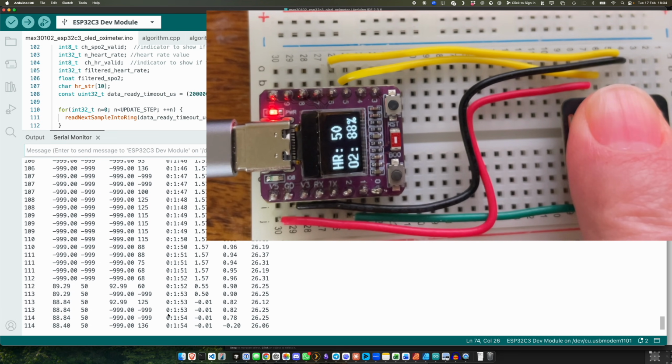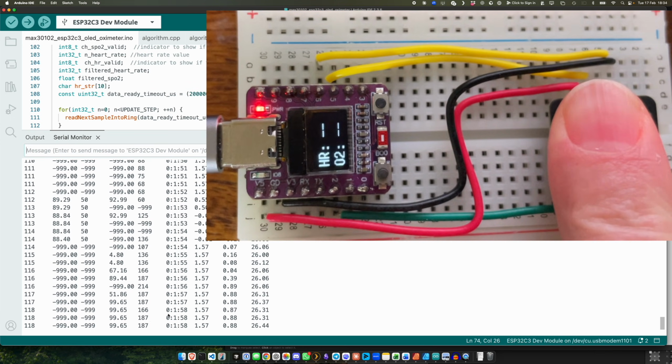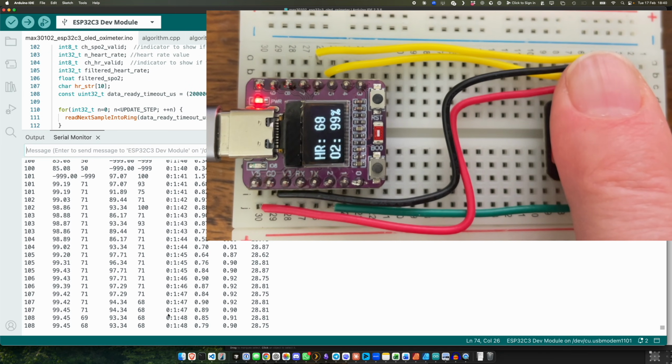There we go. Oh, it came and went. Come on, you can do it. Let's try a different finger. Alright, there we go, that's working nicely. So we're measuring the heart rate and we got the O2 percentage.